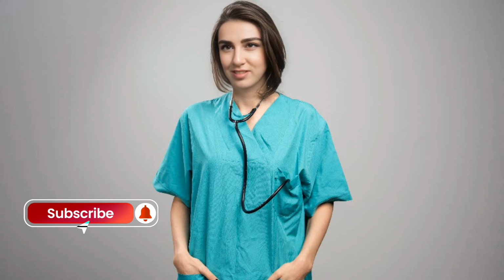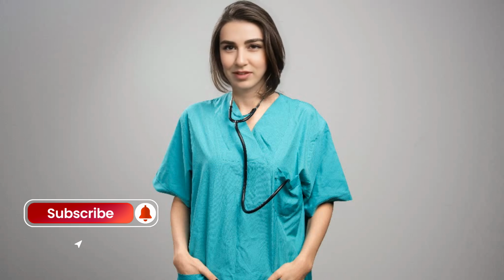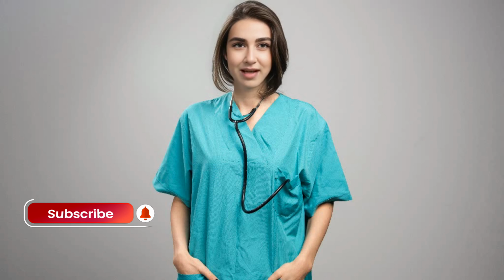4. Final steps. Removing the catheter: the catheter is slowly removed once the artery is open. Monitoring: the puncture site is carefully bandaged, and the patient is monitored for a few hours to a day to ensure there's no bleeding or complications. Recovery: most patients are discharged within a day, with instructions to avoid strenuous activities and to follow up with their doctor.